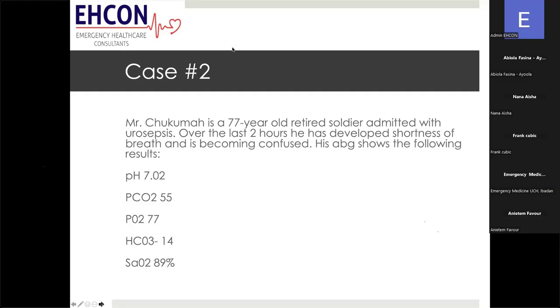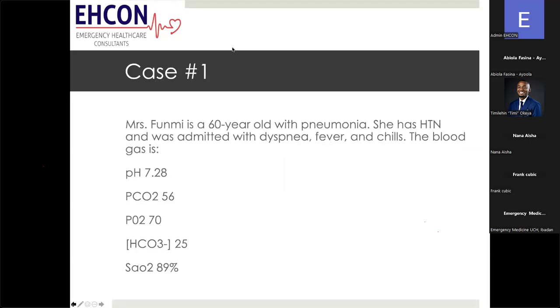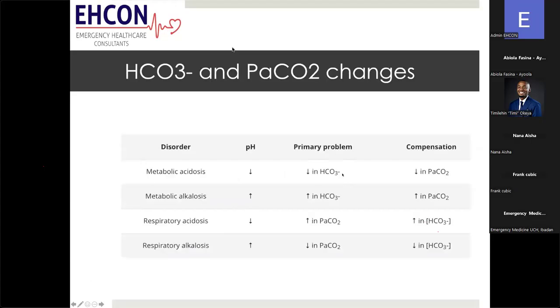So now we have a lowered bicarb as well, which probably contributed to the acidemia. So this indicates to us that we have a primary respiratory acidosis, but we probably also have a metabolic acidosis as well. Because remember, with the metabolic acidosis, your bicarb decreases. The decrease in the bicarb is really drastic, and we have a lower pH.